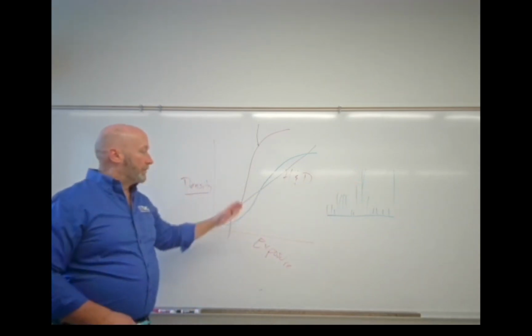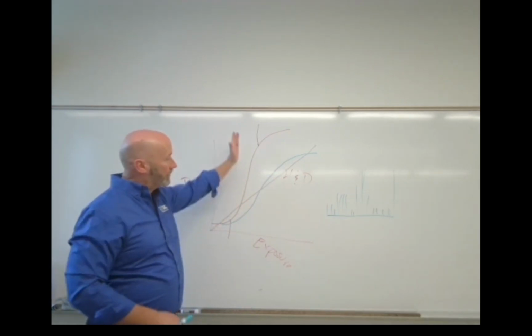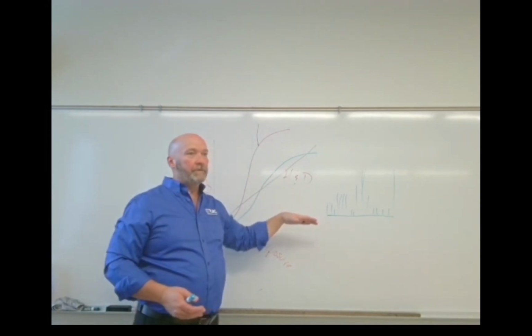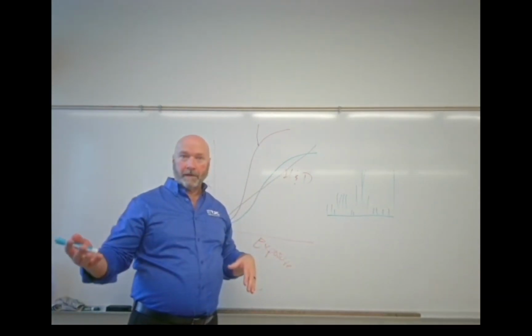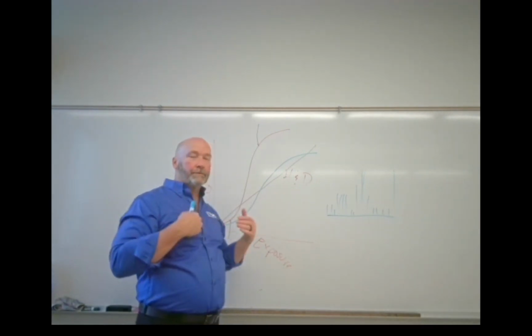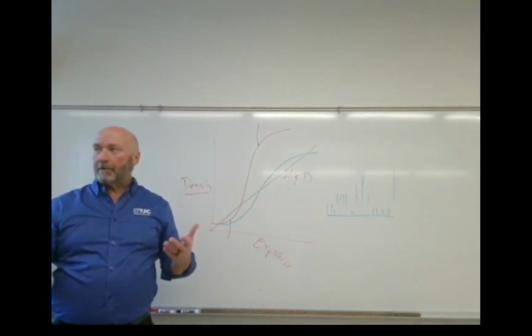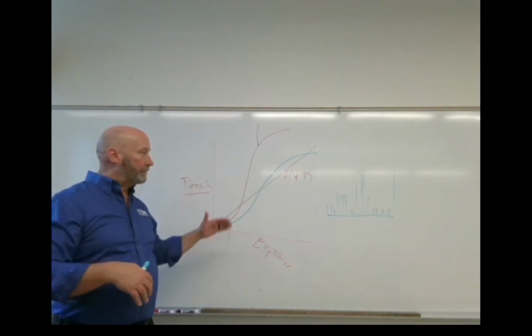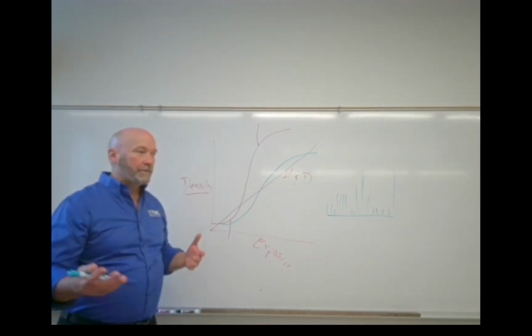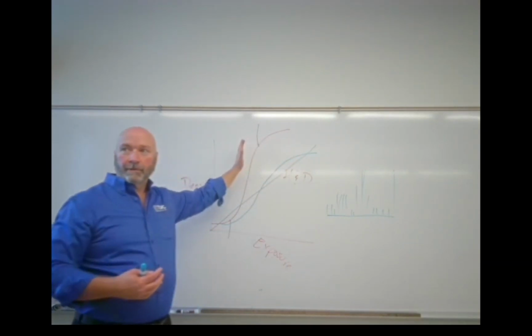Okay? So this one, on the other hand, being more horizontal, so a very vertical H&D curve indicates high contrast. A horizontal H&D curve then would indicate low contrast. So things like chest x-ray, you want to bring the natural, anatomical contrast down some, so that it's not as stark and it doesn't look like ribs. It looks like a chest x-ray instead of ribs. So this would be associated with chest x-ray, extremity work.